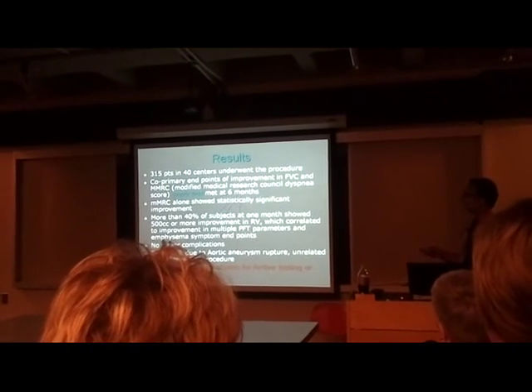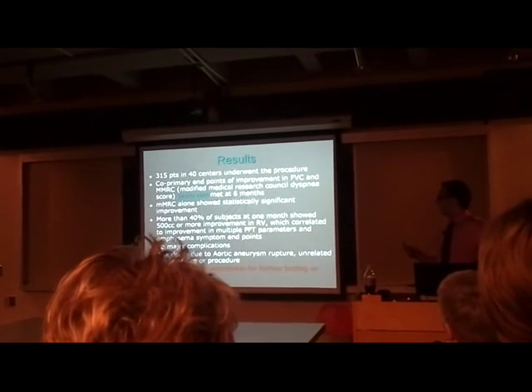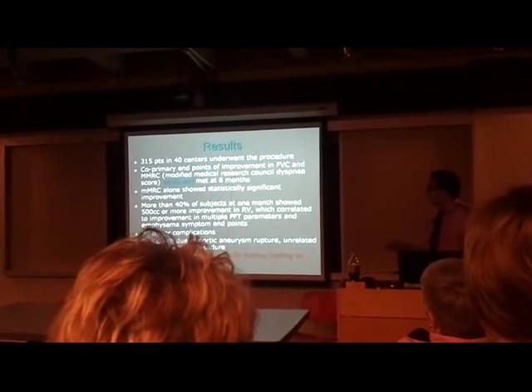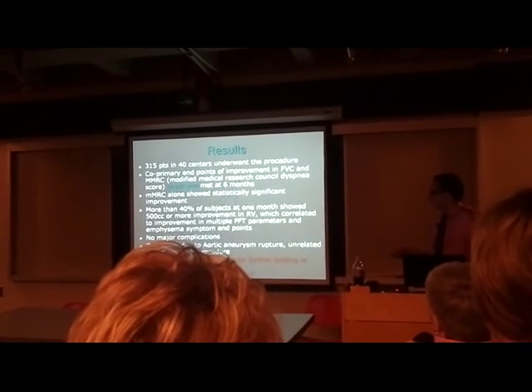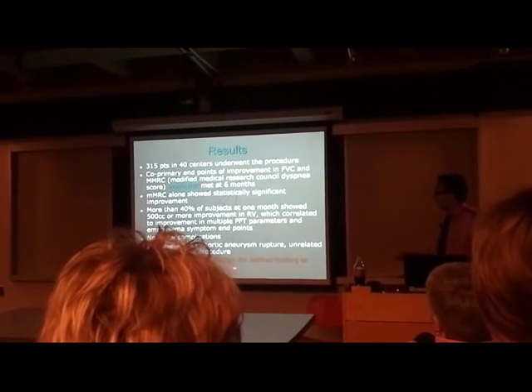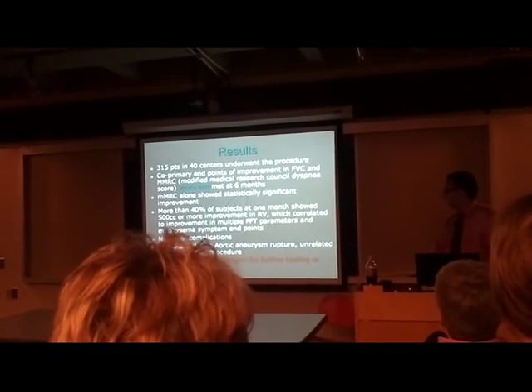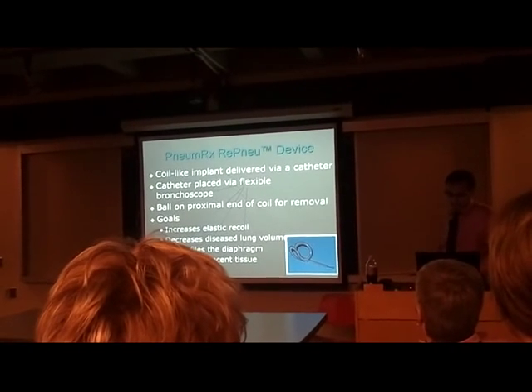In the early part, we had complications of bleeding, because one patient, I think in Pennsylvania or Cleveland, had a blood vessel punctured and had massive bleeding. But otherwise, there was no death. One death happened during our EASE trial, but that was because of an aortic aneurysm. But anyhow, since we didn't get to our primary endpoints, FDA didn't like it, and they were already a little bit skeptical about how involved this procedure was, so they did not grant permission to market this product. So this study is also actually on the drawing board again.